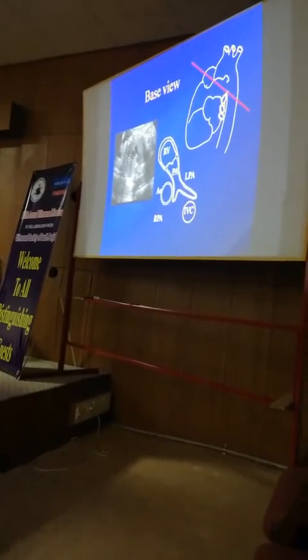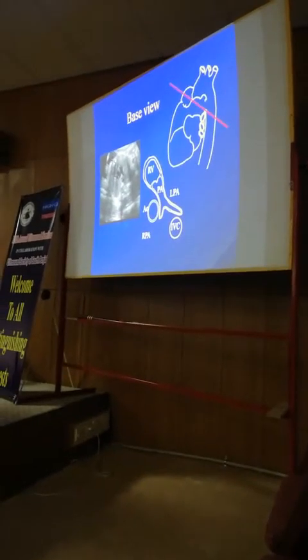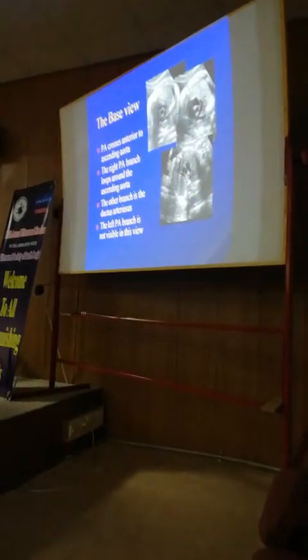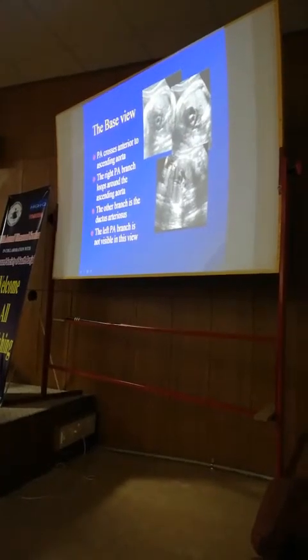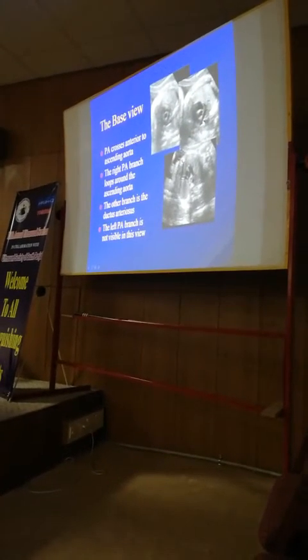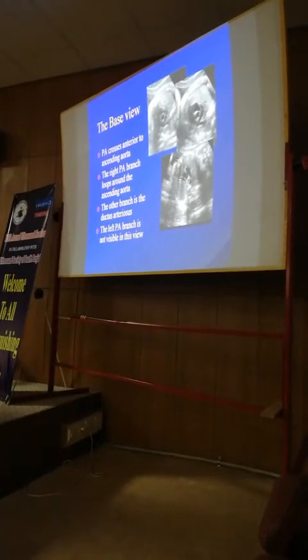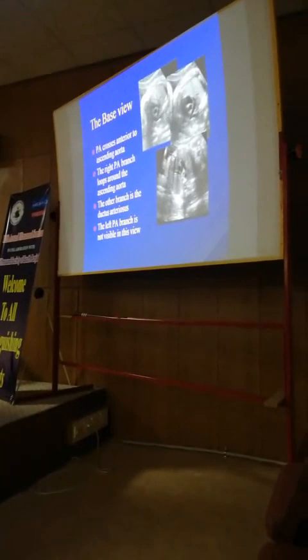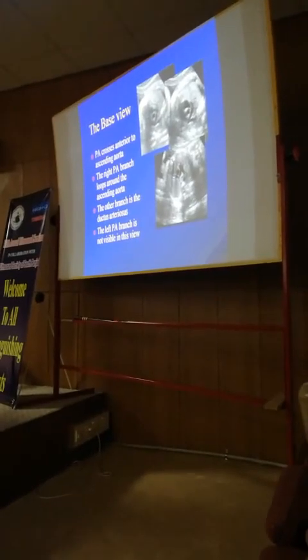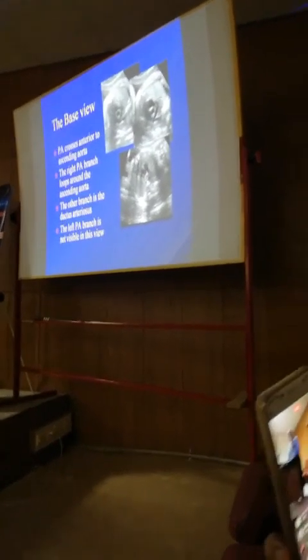Generally left pulmonary artery नहीं नजर आती, but here sometimes you can be lucky and you can see the left pulmonary artery like this. If you see 2 diverging branches, you're seeing both the right and the left pulmonary artery. The ductus goes straight from the main pulmonary artery. So if they're diverging, like a banana peel, then you're looking at the left and the right pulmonary arteries. Most of the time.